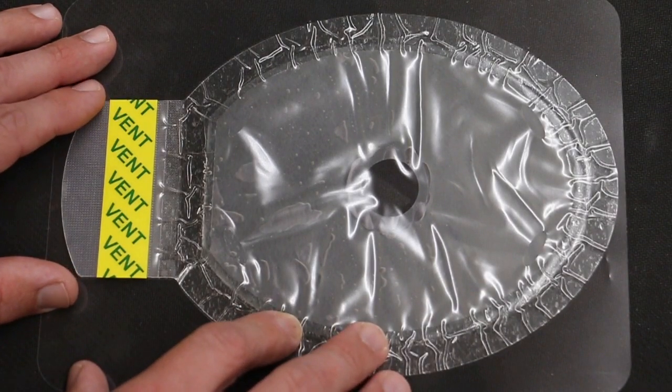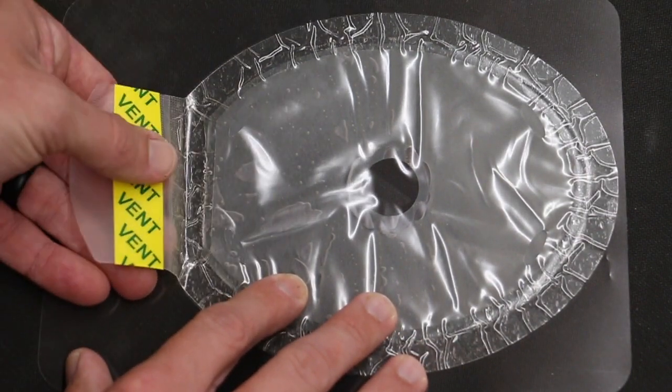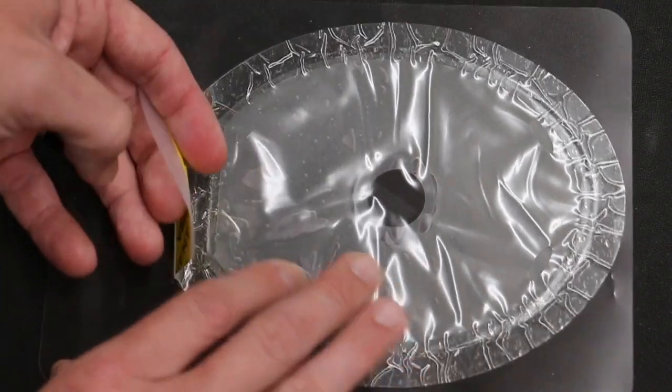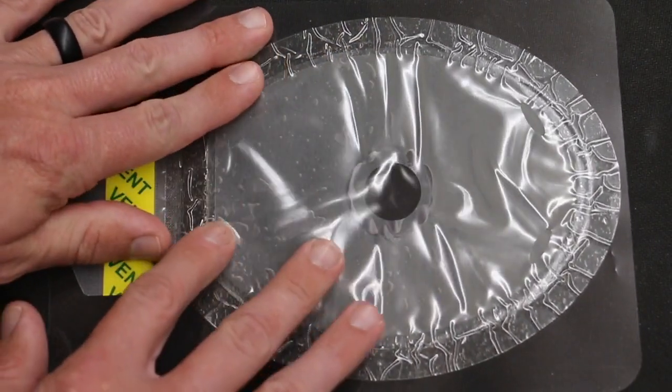So we'll take a little bit closer look here at the vented Halo chest seal. We have a large tab here. This is going to help us placing the chest seal onto the patient. And also, for whatever reason, if the chest seal needs to be burped, then we have easy access just to pull, relieve the pressure, and then seal it back onto the patient's chest.